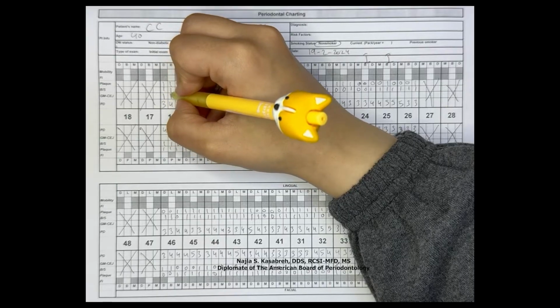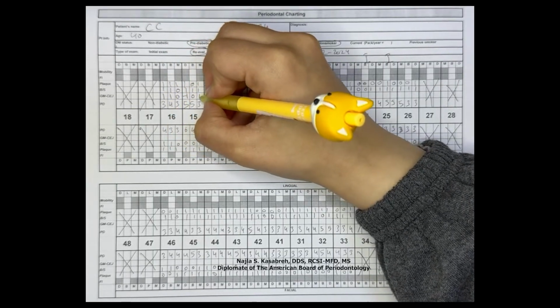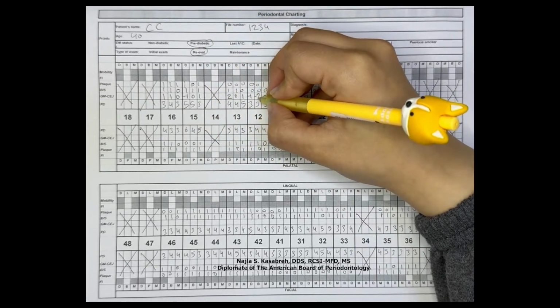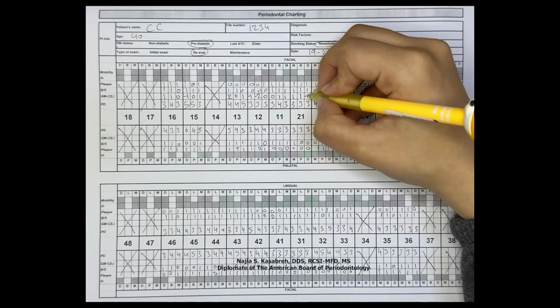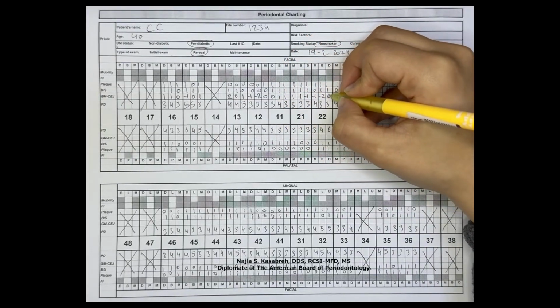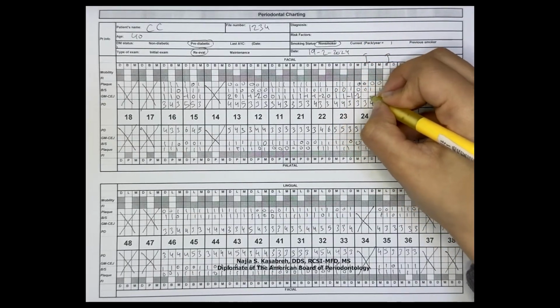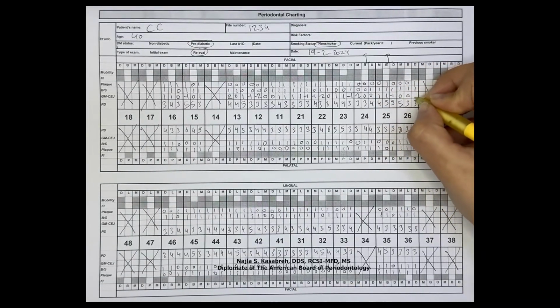Gingival margin is recorded next using the periodontal probe. It is recorded as a positive value if the gingival margin is apical to the cemento-enamel junction, as a negative value if the gingival margin is coronal to the cemento-enamel junction, and as a 0 value if the gingival margin is at the cemento-enamel junction. Don't forget to start from the upper right side and move forward.